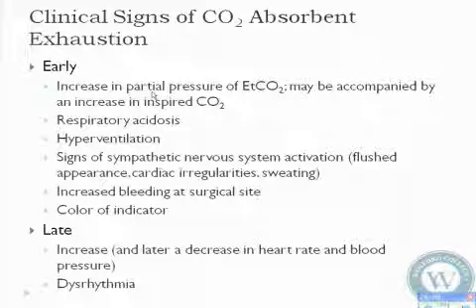You start going through your differential diagnosis. You're going to learn all the different things that can happen, why CO2 increases. But right now, this is one reason why CO2 can increase. Okay, so you troubleshoot this. Is it my CO2 absorber? Of course, anytime you increase your CO2 levels in the body, you can get acidotic. If a patient was spontaneously breathing, they would begin hyperventilating to try to blow off more CO2.